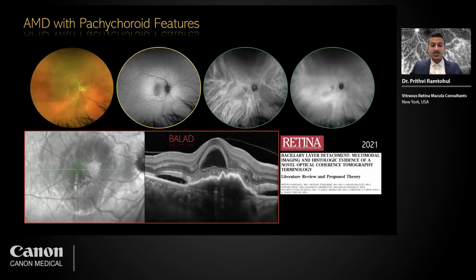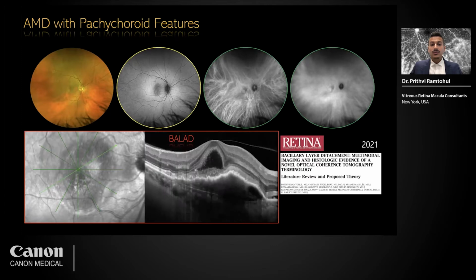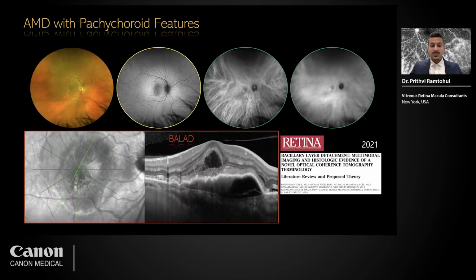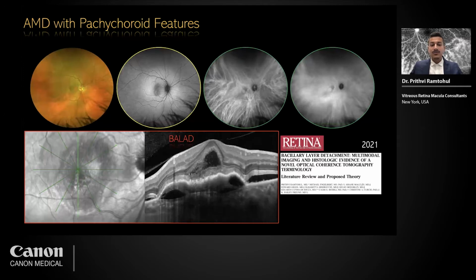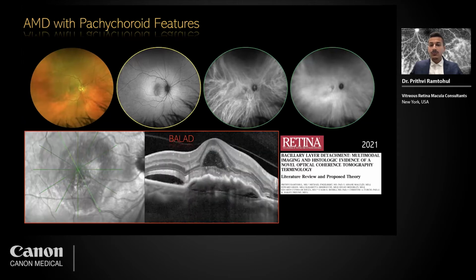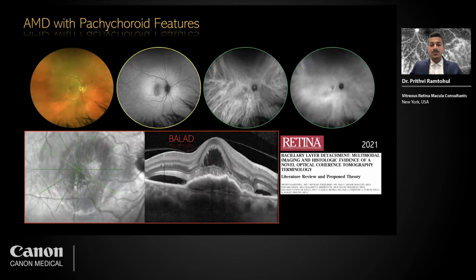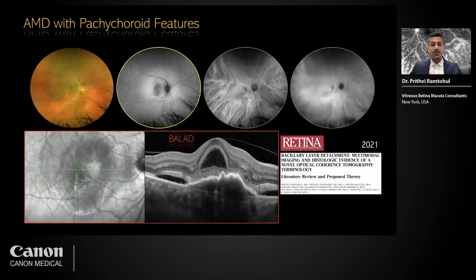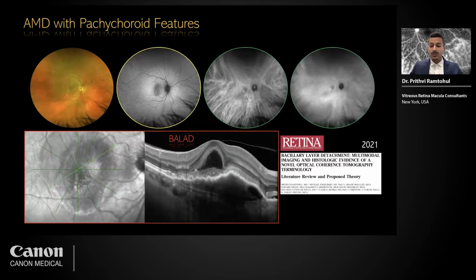En-face wide-field OCT may also be helpful to identify subclinical forms of choroidal venous congestion in patients with unrelated retinal disease. As you know, a pre-existing choroidal venous congestion may influence the disease manifestation, resulting in more significant retinal fluid accumulation. For instance, bacillary layer detachment is a subtype of subretinal exudation characterized by a split at the level of the photoreceptor inner segment myoid and resulting in fluid accumulation.